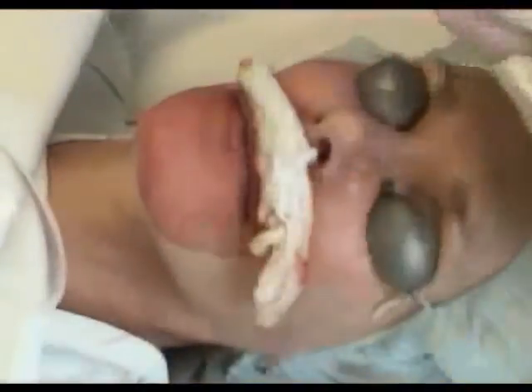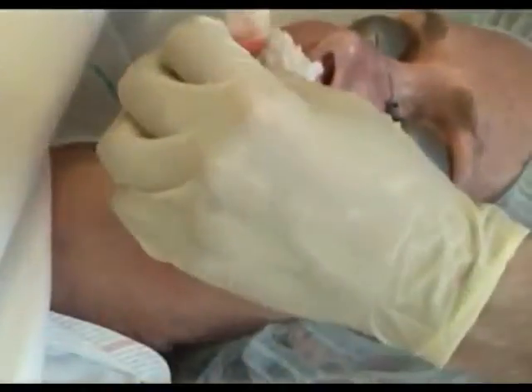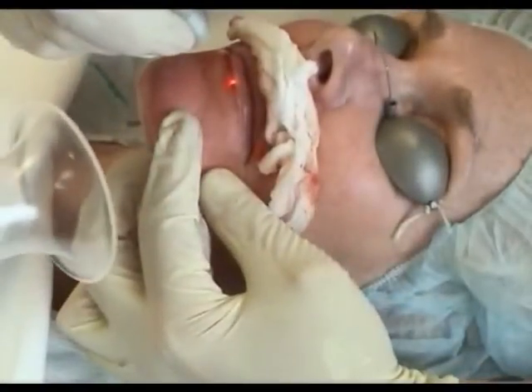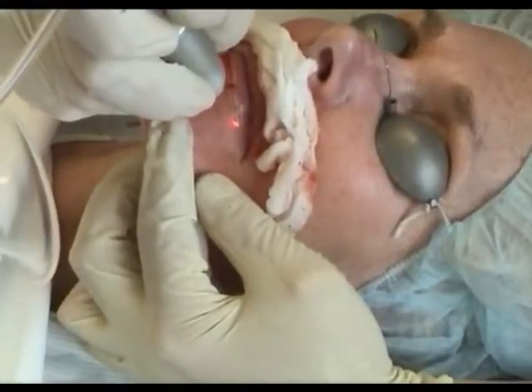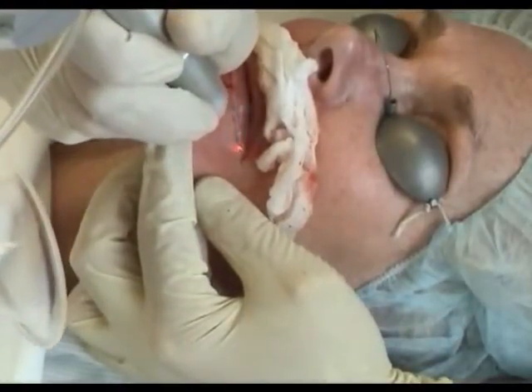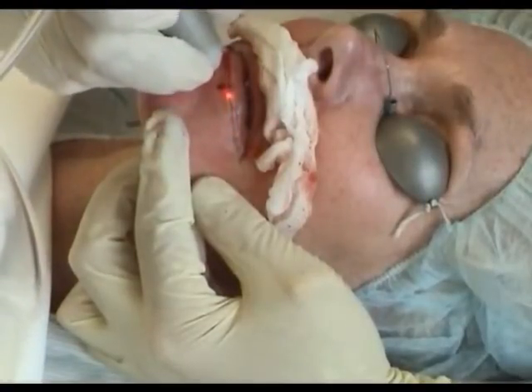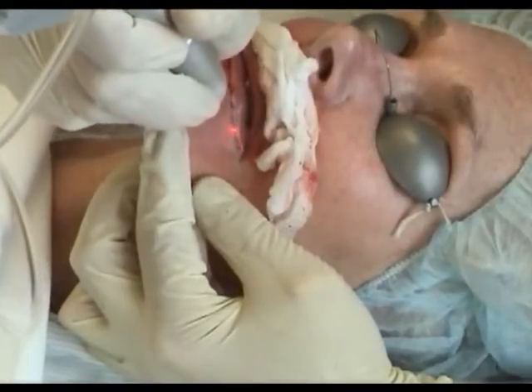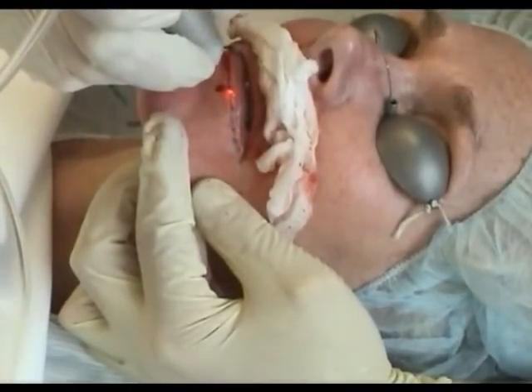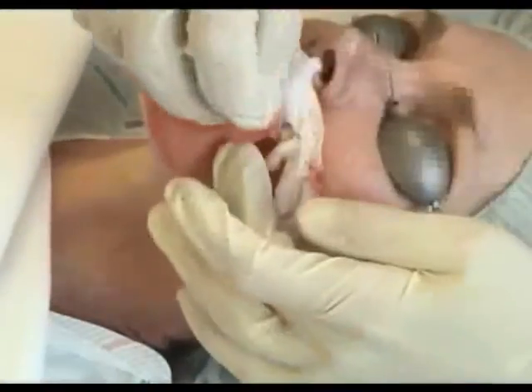Cosmetic tattoos may also be improved with resurfacing lasers. Instead of using lasers designed to treat pigmented lesions, which oftentimes require multiple treatment sessions and may turn some of the cosmetic tattoos a dark black color, a single session with the resurfacing laser may achieve the goal of removing the cosmetic tattoo. Here, a permanent lip liner is being removed with an erbium YAG resurfacing laser. The 3mm spot size is being used with a fluence of 12 joules per centimeter squared.